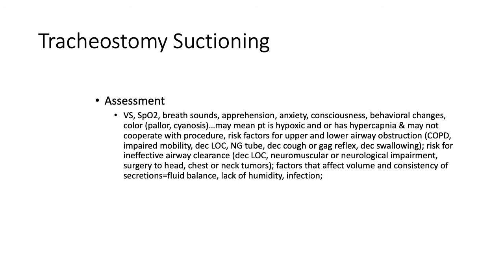After you introduce yourself, when you ask them for their name and date of birth and allergies, and if they know what the date is or the day of the week, are they able to answer you appropriately? If they're not, then that might indicate hypoxia and a need for suctioning. Are they apprehensive or anxious because they're hypoxic or they need to be suctioned? Additionally, if they are anxious, or if they have an altered level of consciousness, just be alert that they may not be able to cooperate with the procedure, so you might need to get some help.